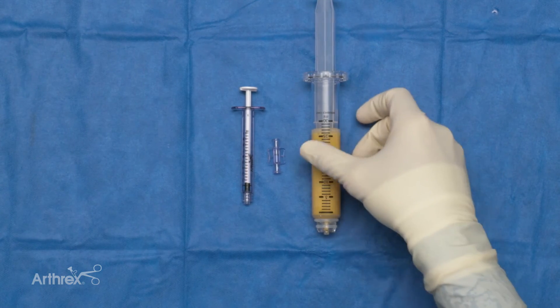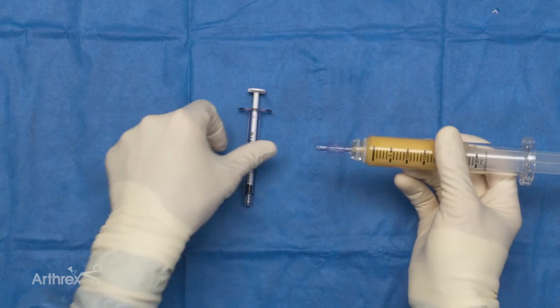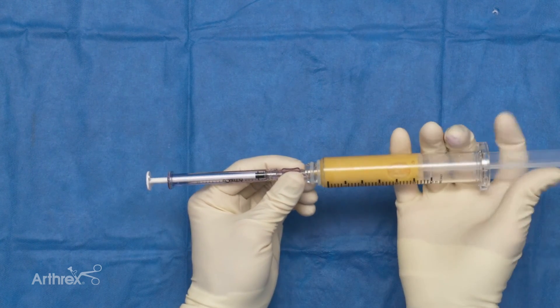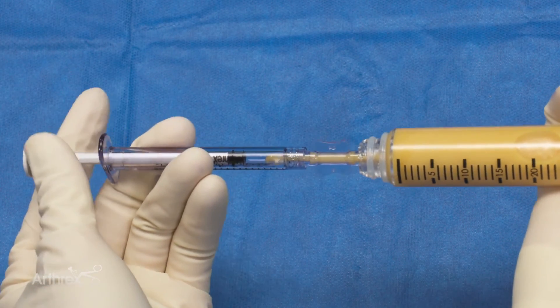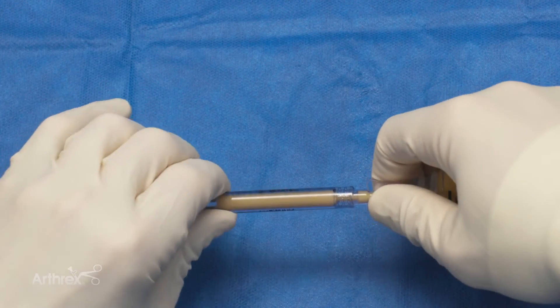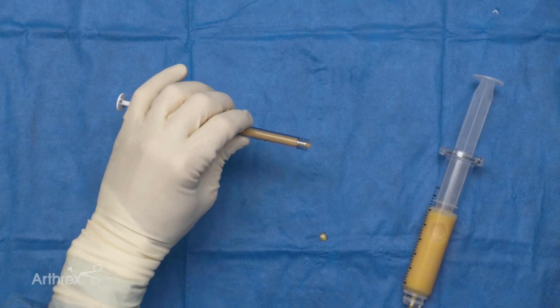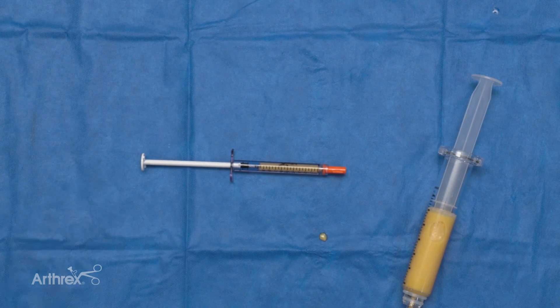We have our final product ready for transfer, so we hook up the syringe to our final application syringe using our luer-to-luer. I like to control both sides — give a gentle push on the side where the final product is and a pull on the side we're transferring to; that helps you control the volume. Then simply unhook and cap and you're ready for use. The adipose system is an ideal system to efficiently and safely harvest, rinse, and resize adipose tissue.